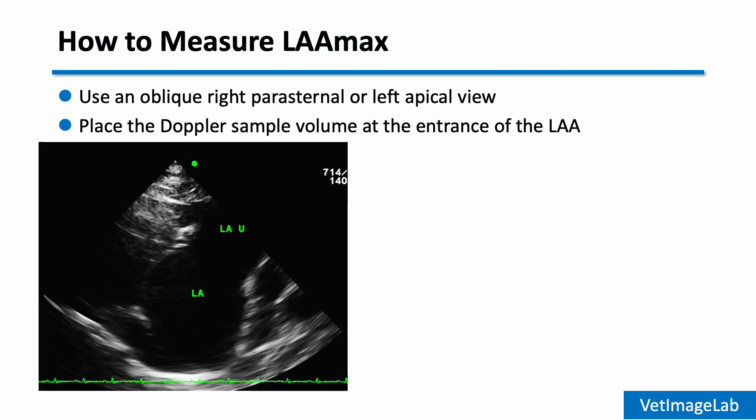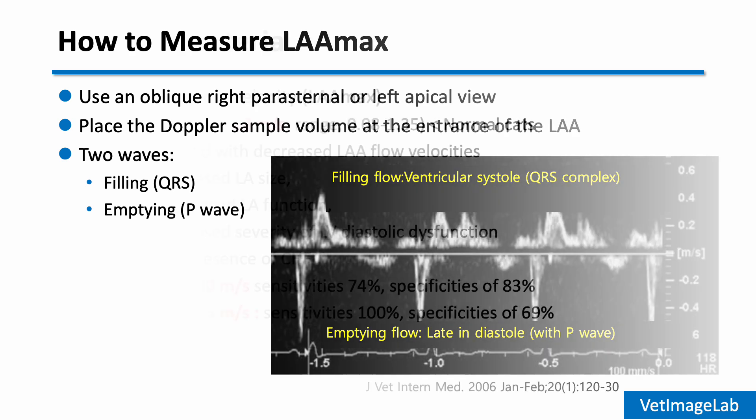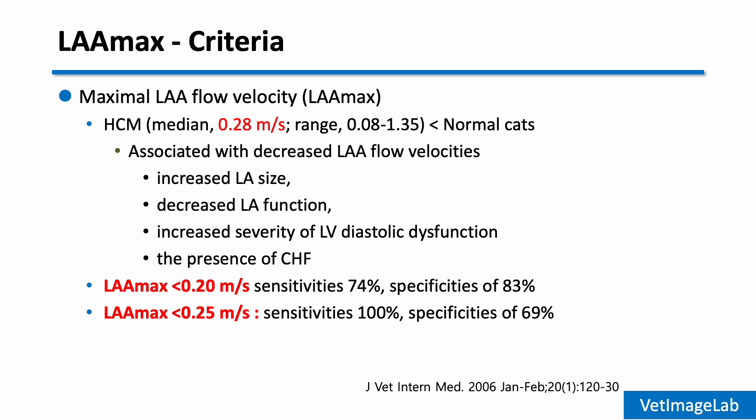Maximum velocity of the LAA is measured using pulsed wave Doppler at the entrance of the left auricle. You can use an oblique right parasternal or left apical view, depending on the cat's conformation and image quality. We typically observe two waves: one during ventricular systole and one during atrial contraction. A maximum LAA velocity less than 0.20 m/s is highly specific for the presence of spontaneous echo contrast or thrombus. A threshold of 0.25 m/s is more sensitive.